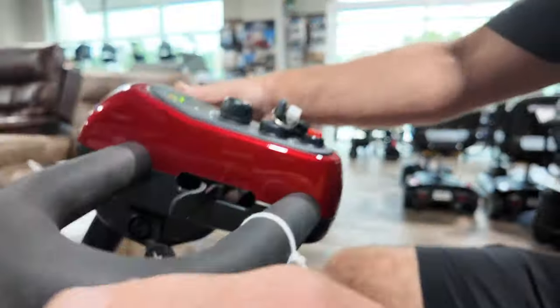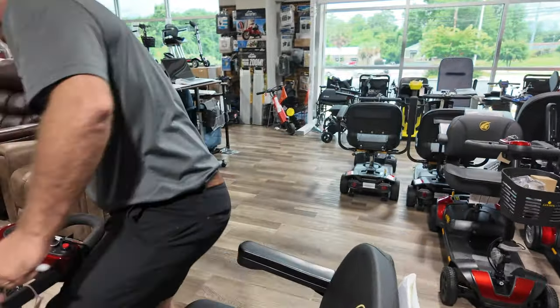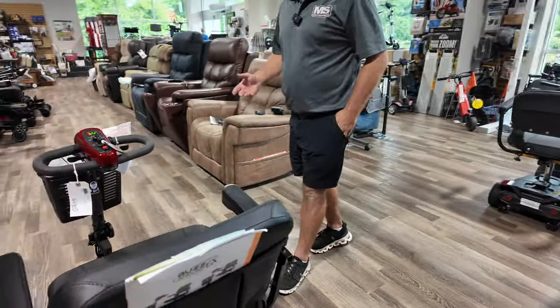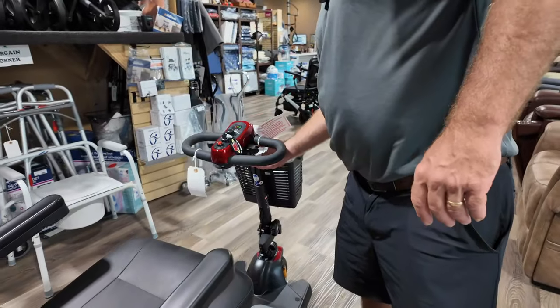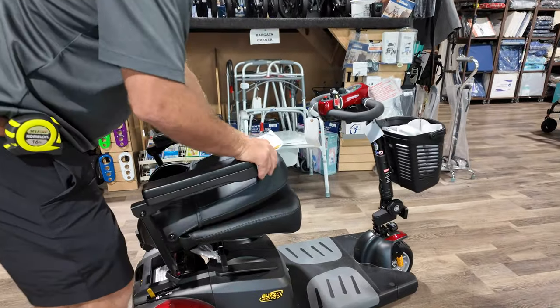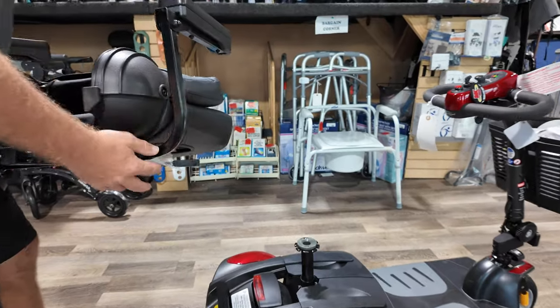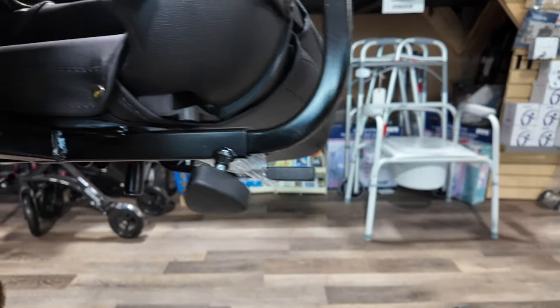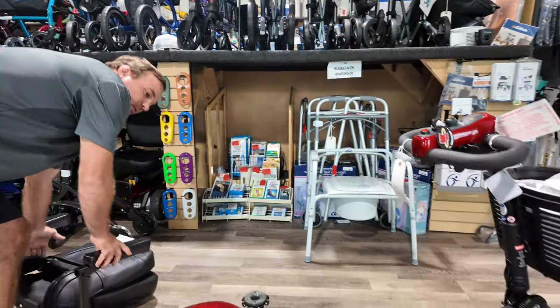They also make an LX version that has a feather touch to bring the tiller back and forth to you. But this model can be taken apart. It's going to be a little heavier than something like a Go-Go scooter. To disassemble, the seat just pulls straight up. On this seat you can adjust the arms, and this is your receiver port to add a basket, oxygen tank holder, or something different. You also have adjustments for seat height.